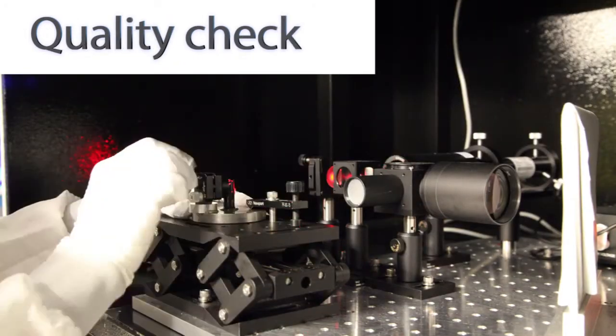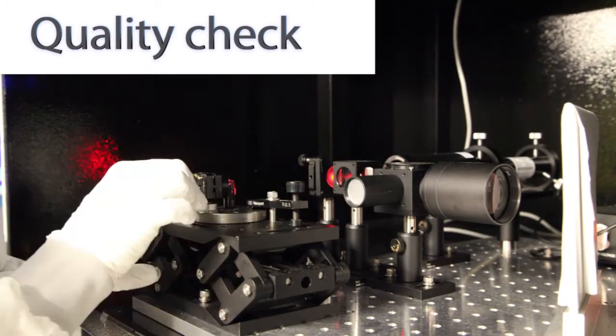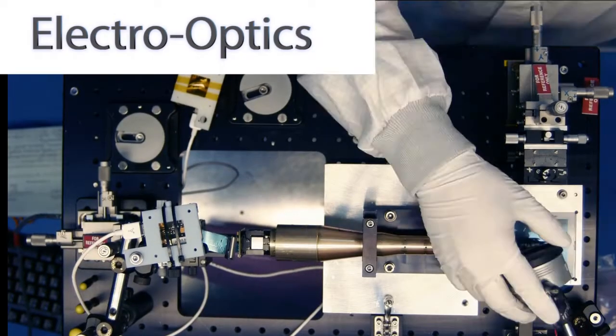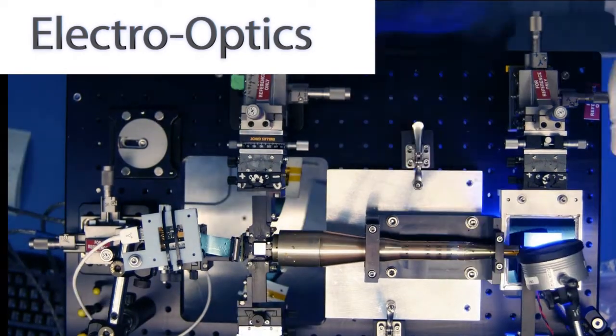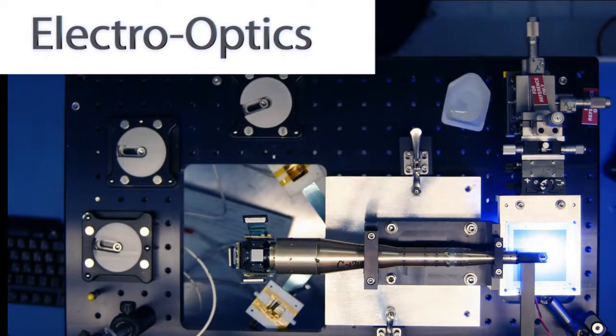To measure the alignment of the objective components, we build a custom interferometer with pass-fail criteria. Electro-optical assembly combines the optical tube with the image sensors and the illumination source.